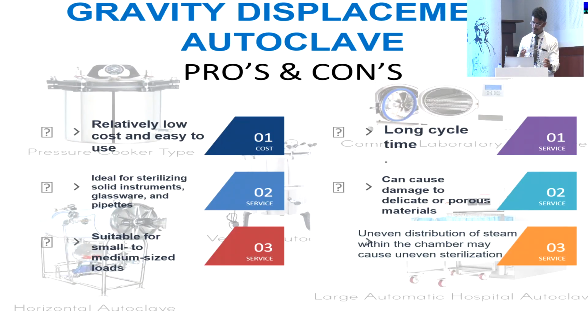So let's discuss the pros and cons. Relatively low cost, ideal for sterilizing solid, remember, solid instruments, and suitable for small to medium sized loads. But like I mentioned, cycle time is long and it can cause damage to delicate instruments.